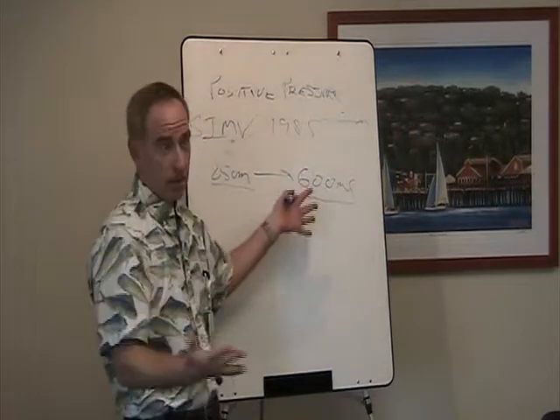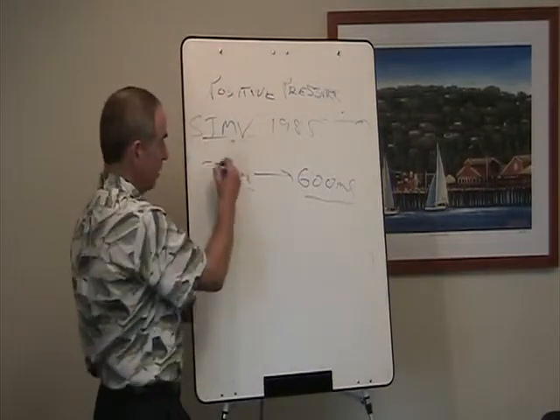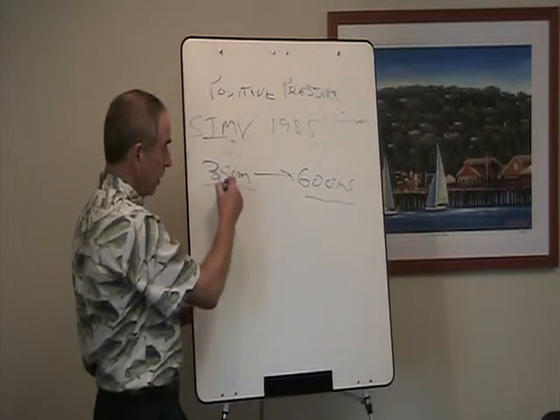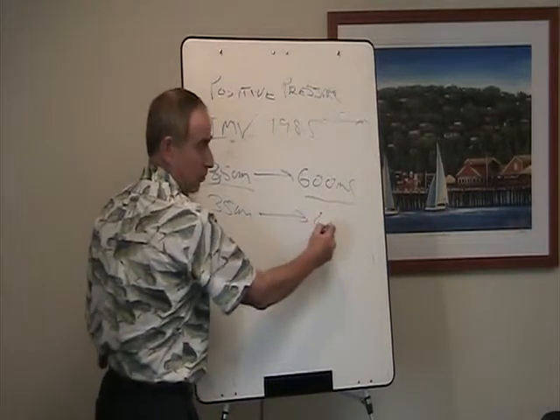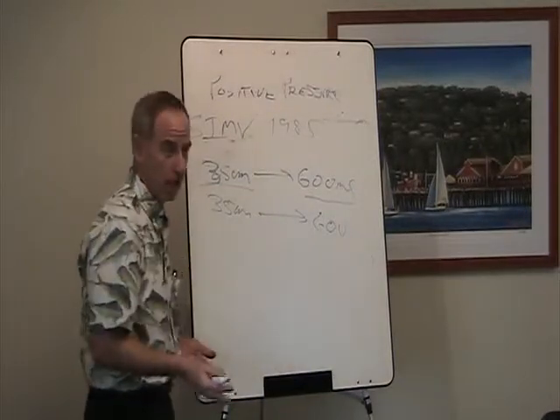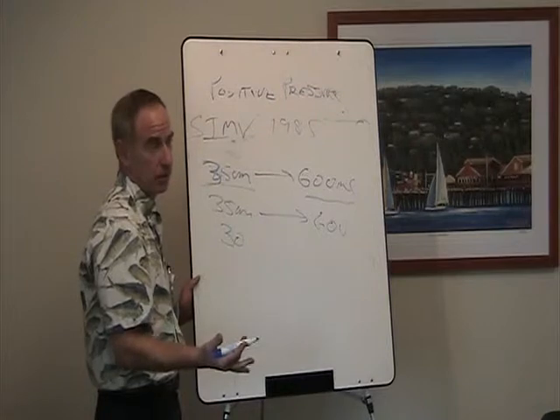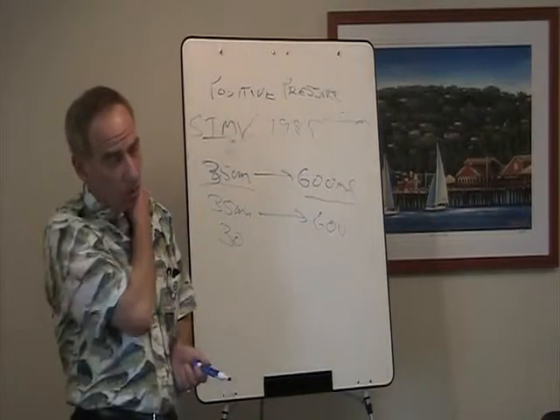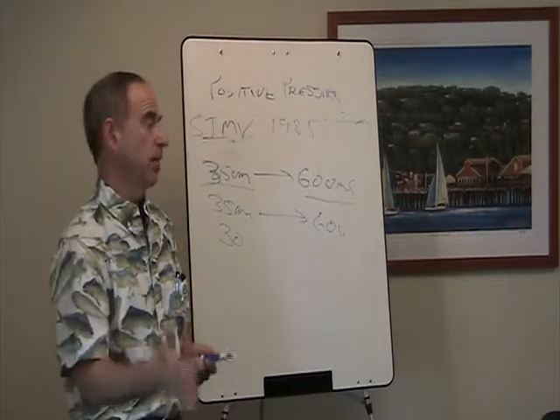Now, intuitively, based on what I just said, it shouldn't make a difference, right? If I go from a 600 cc volume cycle ventilation and it's generating, say, 35 centimeters, it's taking 35 centimeters to get this volume. If I switch into pressure control and I give them 35 centimeters, it should just give me 600 cc's, right? I mean, the physics of it. But in fact, it doesn't work that way. And it may only take 30 centimeters of pressure to give that amount of volume. The reason is the difference in the way the flow and the gas is delivered between the two different modes.